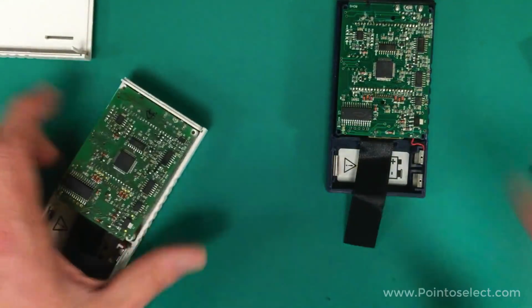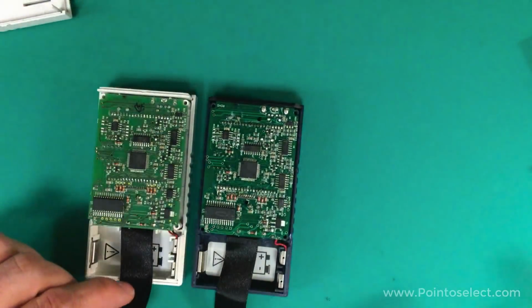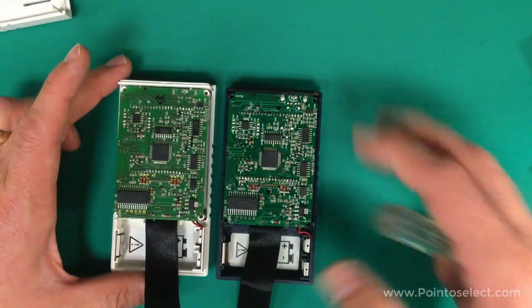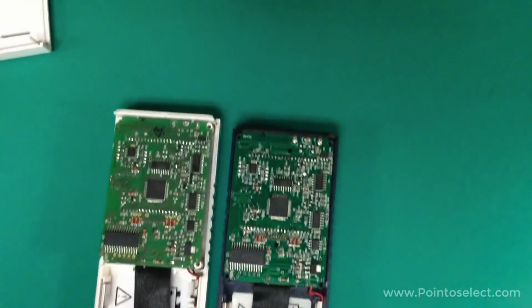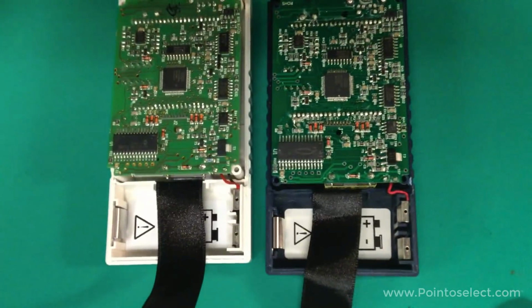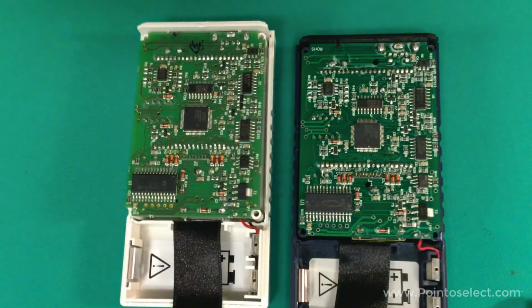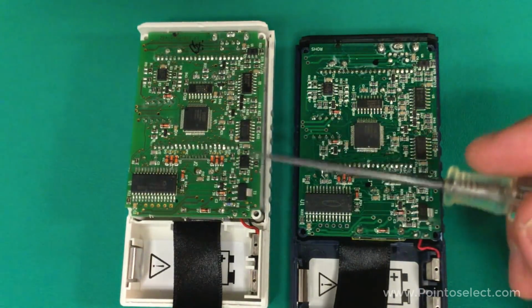Okay, there we go. What do we have inside? Well, to start with, they both look pretty darn identical. Let's see if we can get the camera a little closer here. Yeah, there we go. We've got the same board, same layout.